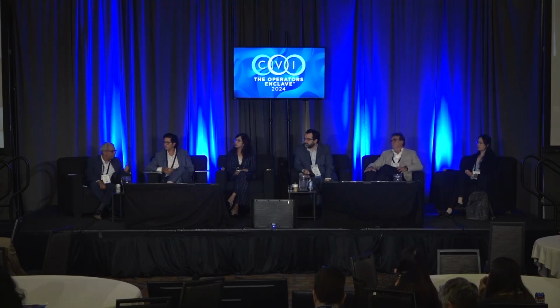So we have devised some new descriptions that we're working on with the core lab, where we describe not a leak, but more like a fold or a little pocket. Because if you look at the way the tissue wraps, there could be some little folds that look like a leak, but they actually don't communicate with the appendage. So there'll be some interesting findings there. Ultimately we'll see what the data show in the pivotal trial.